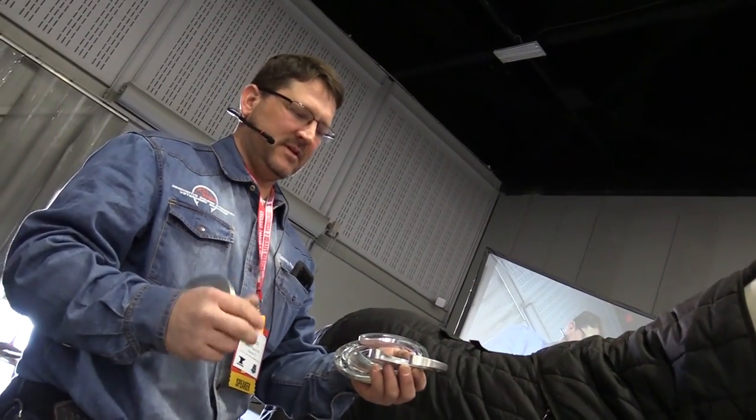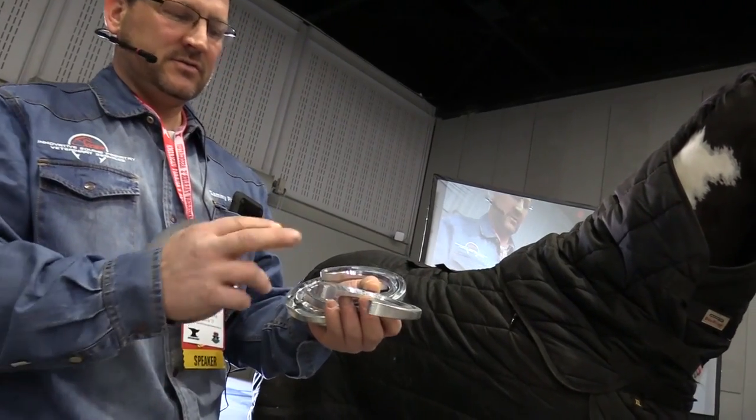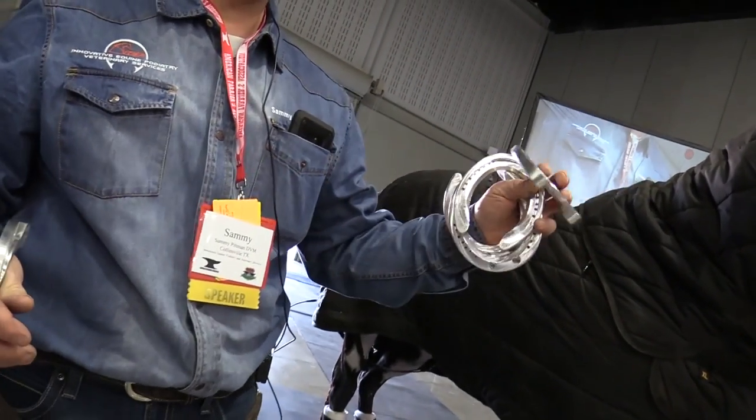This is a maintenance shoe for a lot of my horses that maybe recovered, or maybe I'm just managing biomechanics. I'll use this 2 degree aluminum wedge and then again put a little bit of a rocker into it.